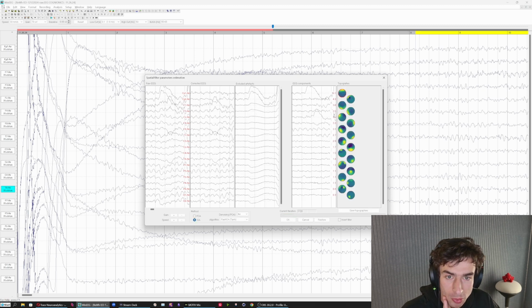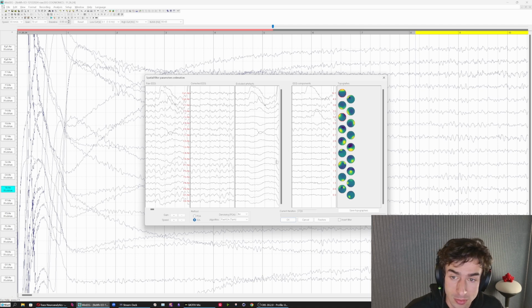And what I'm looking for is a better lateral eye movement component, which it looks like we now have. So I've now selected that first eye blink component, which is about the same, and we now have a second component down here, which is actually the fifth one down, which is exactly what we would like to see for lateral eye movement, where the positive and the negative of the dipole are on opposite sides of the front of the head.